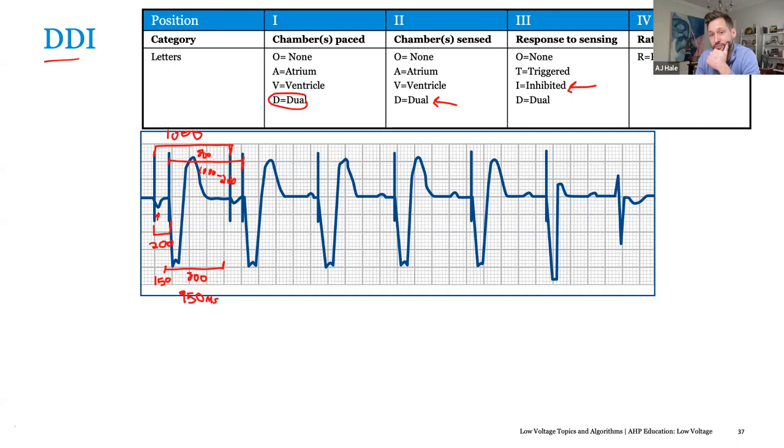What you saw on the EKG and what we think is the intrinsic activity, the native activity of that patient. So now for people with AV block, because that is the commonest one we see here, what do you recommend commonly around here? Then also another set of people we see occasionally are those with permanent AF and who had a slow ventricular response. And usually this group of people are more of 80 something years.